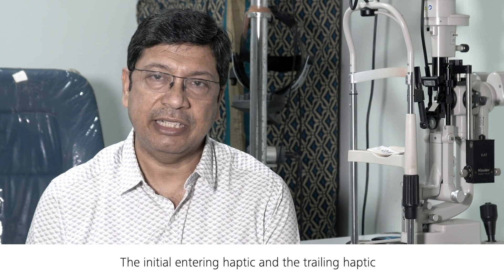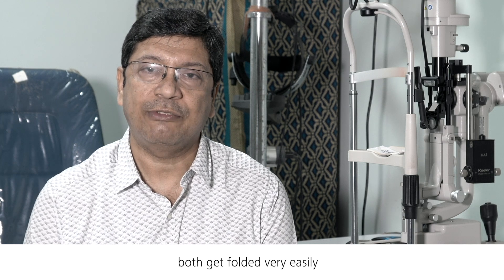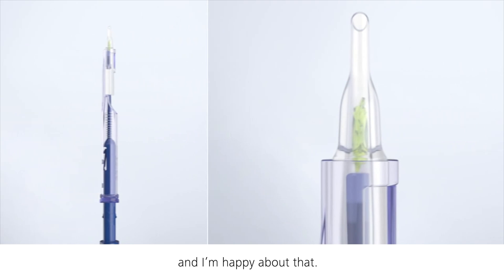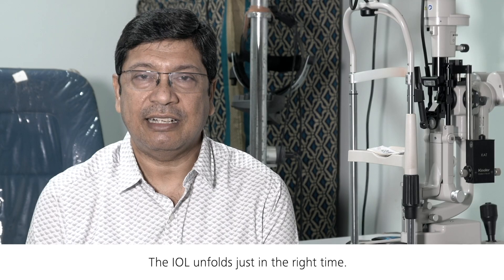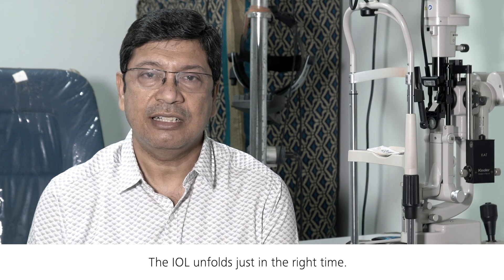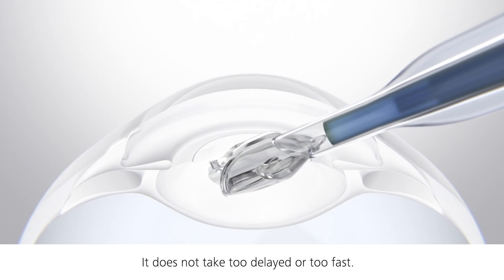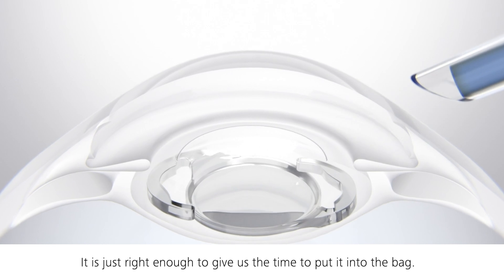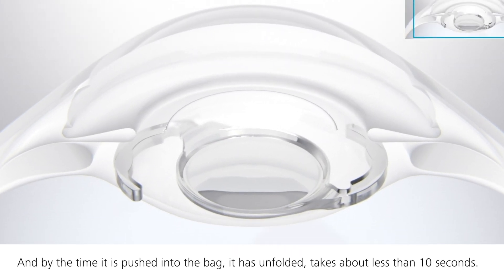The leading haptic and the trailing haptic both get folded very easily, and I am happy about that. The optic-haptic junction makes it easy to hold and push in. The IOL unfolds at just the right time — not too delayed and not too fast. It gives us just enough time to place it into the bag, and by the time it is pushed into the bag, it has unfolded. It takes less than 10 seconds.